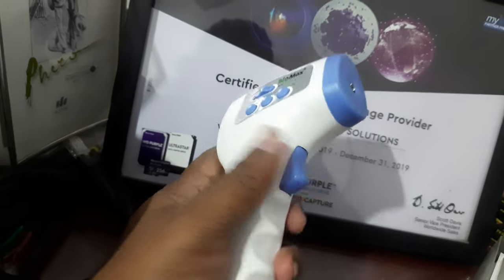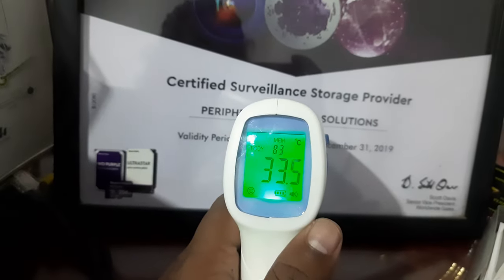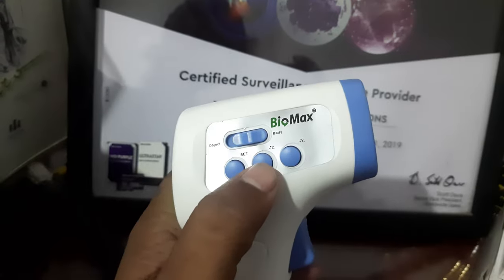Once you press this, you will get it in Celsius or Fahrenheit. This button is for Fahrenheit and this button is for Celsius.